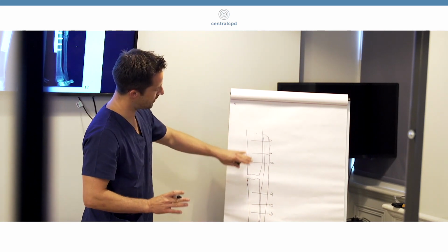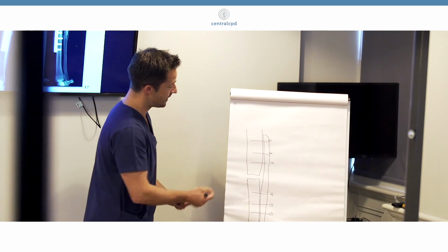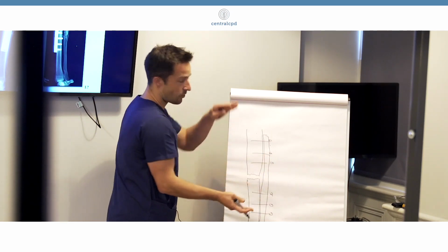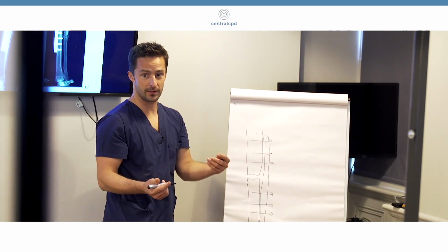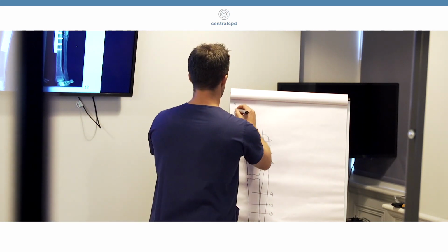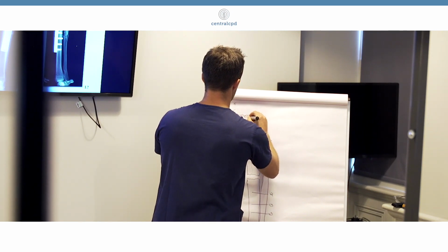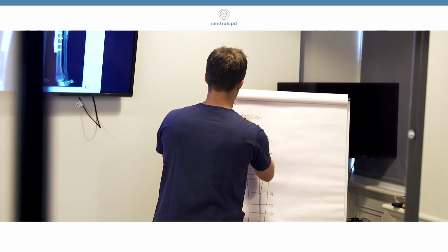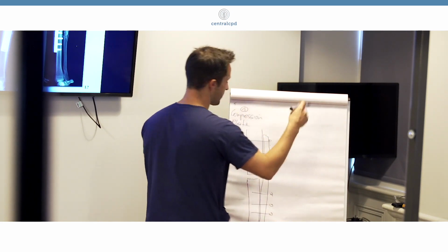What we do in a reconstructible transverse fracture is that we even compress the fracture, and then we can achieve primary bone healing. So this is a compression plate. And you will hear more about it through the day.